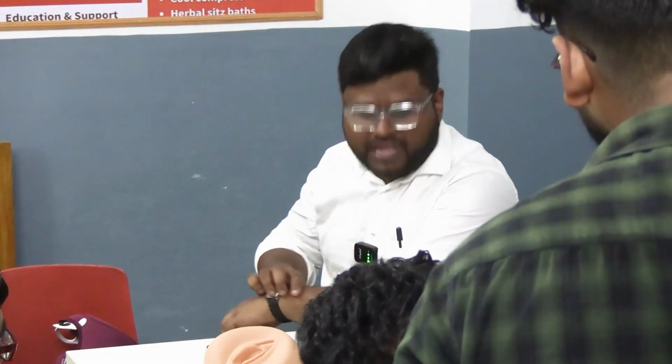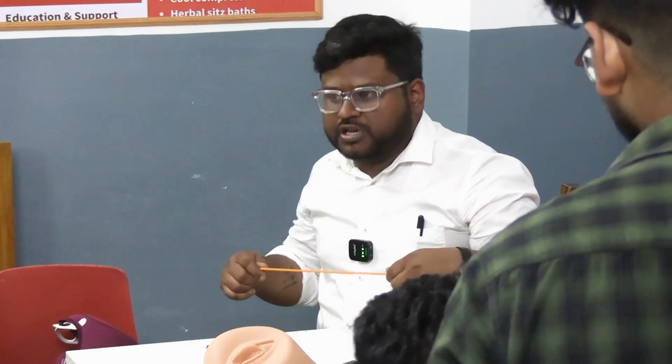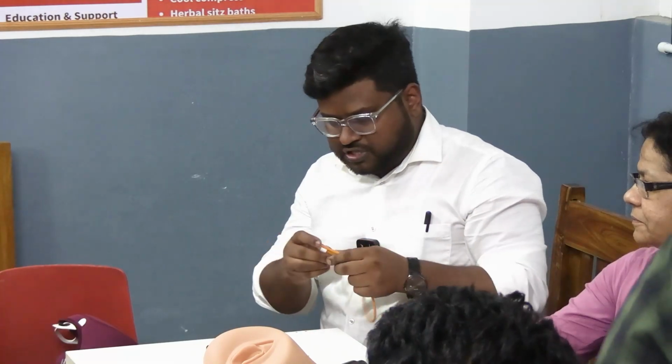Below, a value is written in ml. What is the ml? 5 to 15 ml. I think this will also be taught to you in the instrument class. This catheter has two channels. One for the drainage of urine and one for giving saline, for inflating a balloon.